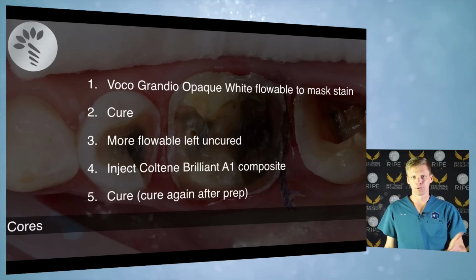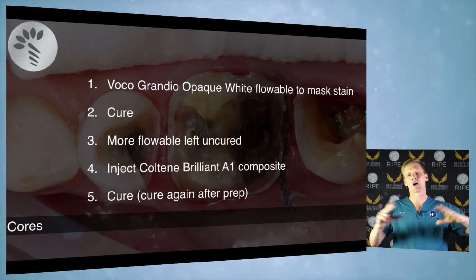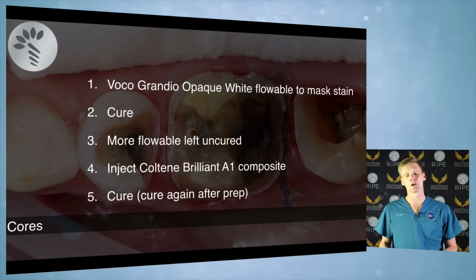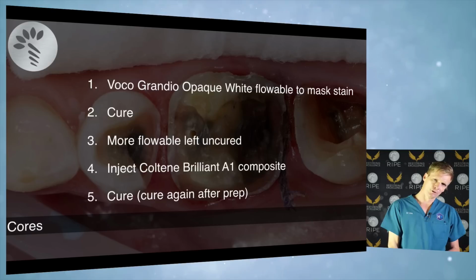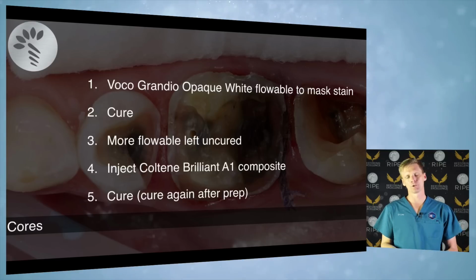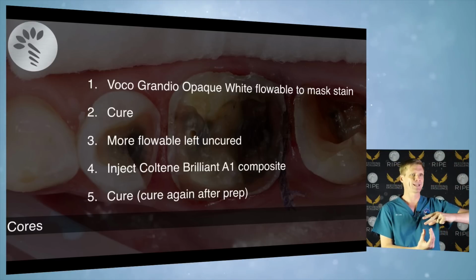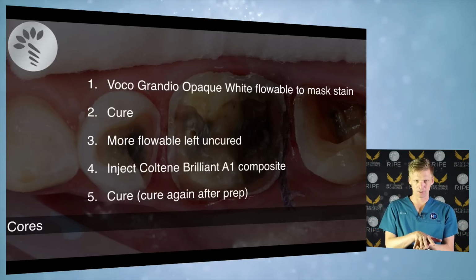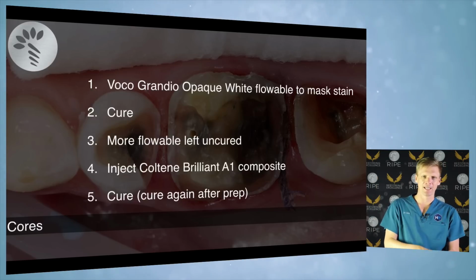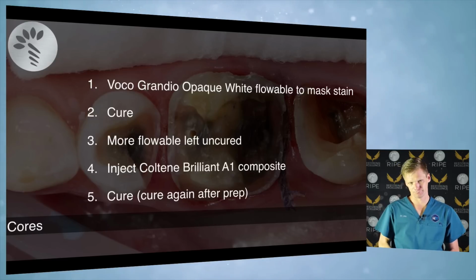Now, after you prep, you cure again, because you are curing through a fair thickness. It's not super thick. You don't need to worry about shrinkage because these are big open cavities. So the cavity factor or the C factor is usually 1 or 2. It's very low. But you are curing through a fair thickness of material. So when you finish the prep, cure it again and cure it with a bit of water or something. Otherwise, you can leave some uncured side chains, and you'll put your Pro Temp or Luxa Temp or Maxi Temp or some type of bisacryl on top if you use bisacryl. If you use acrylic, it's slightly less of a risk, but you'll put something on top and it will stick together, and then you end up with your temporary bonded to your crown prep, which is very depressing.